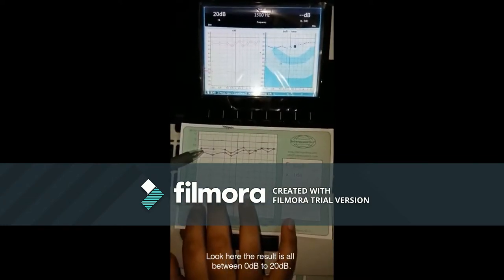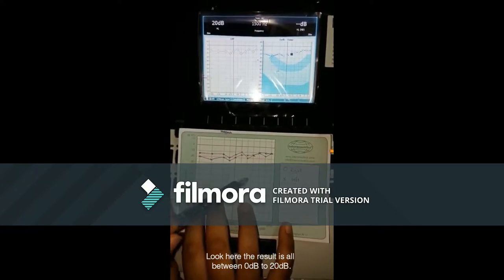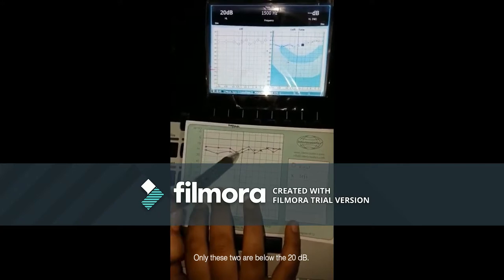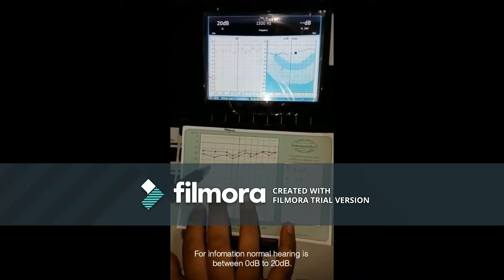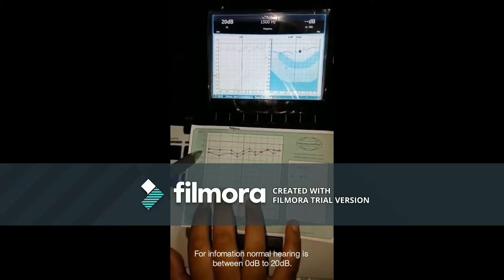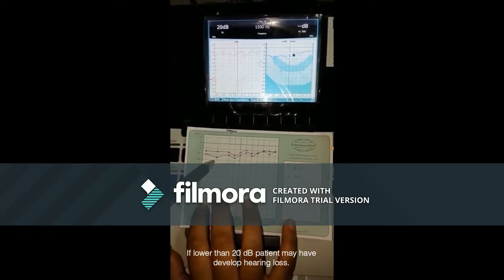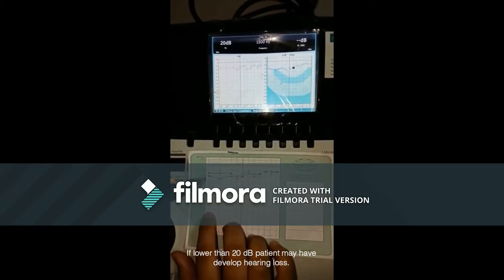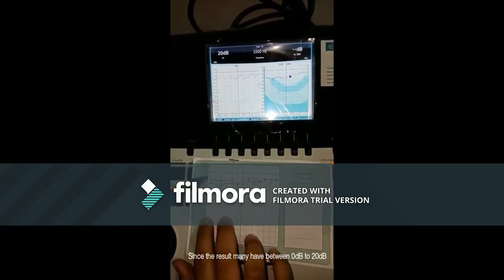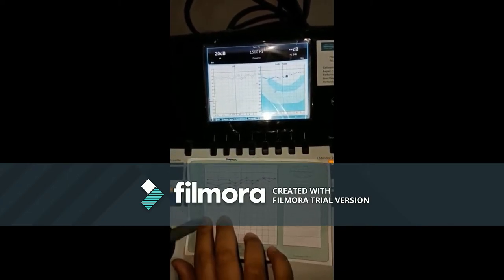Look at here. The result is all between 0 to 20 dB. Only these two are below 20. For information, normal hearing is between 0 to 20 dB. If lower than 20, the patient may have developed hearing loss. Since the results are mostly between 0 to 20, it indicates the patient is normal.